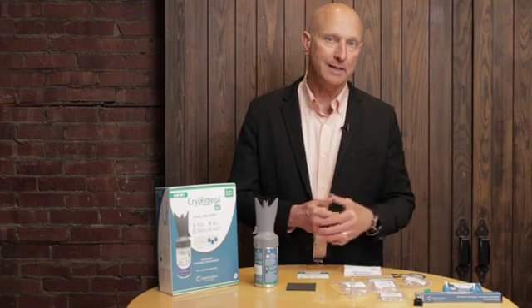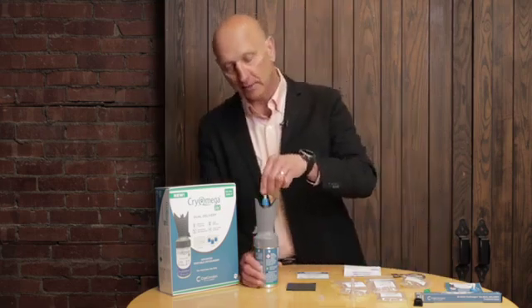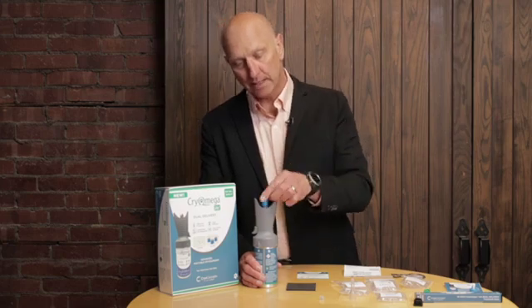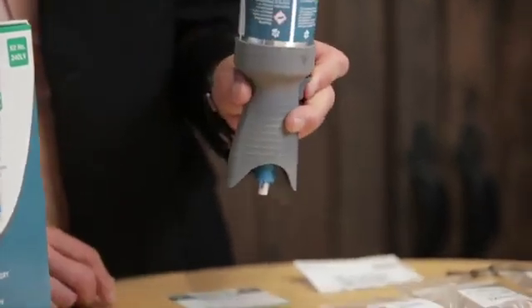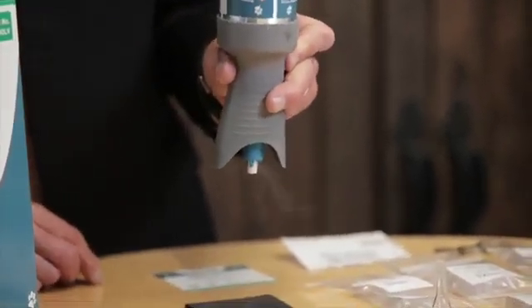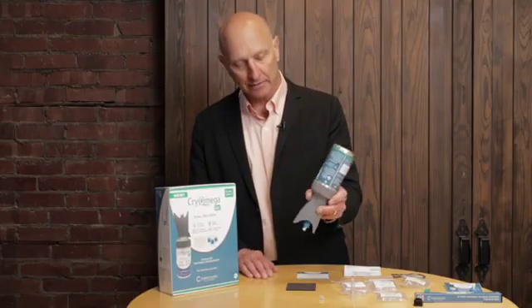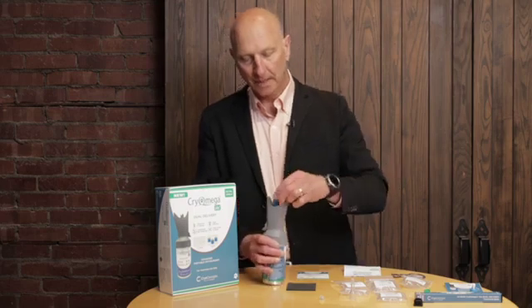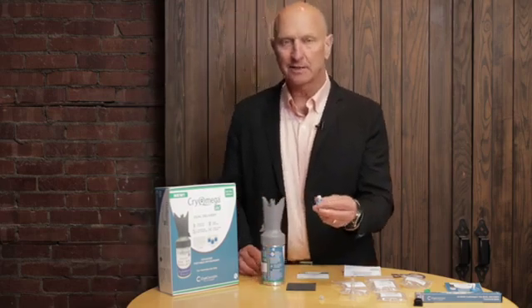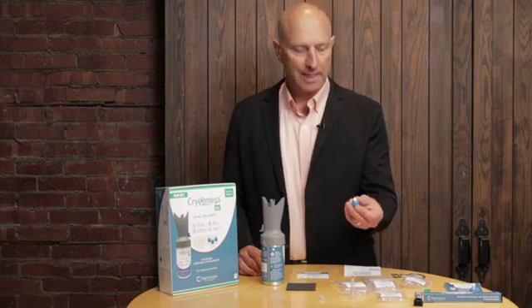What also can be done with the dual delivery kit is the use of buds or applicator tips. Here, they too get attached to the top of the unit. It's turned upside down. The trigger again is pulled for 3 to 5 seconds. Release. Now the tip itself is immediately ready to be used and could be placed directly against the lesion and held there for the number of seconds, depending on the lesion, or it can be removed from the canister itself and used remotely around the patient in whatever location is most appropriate.